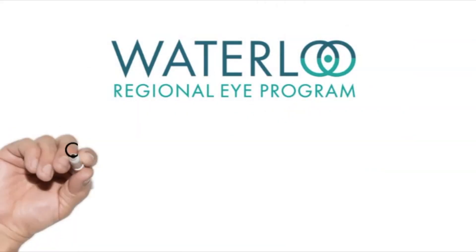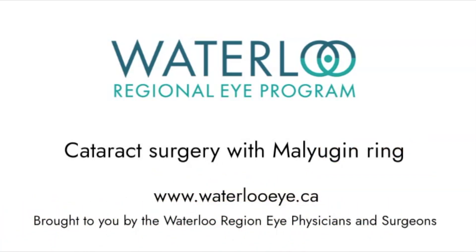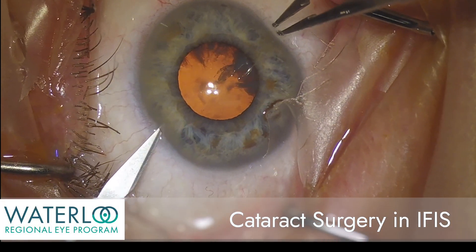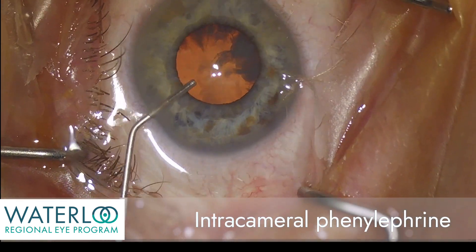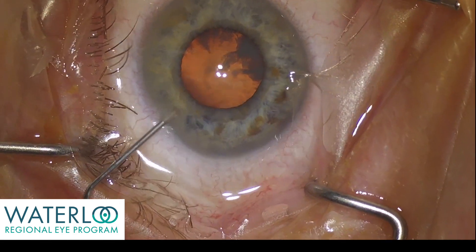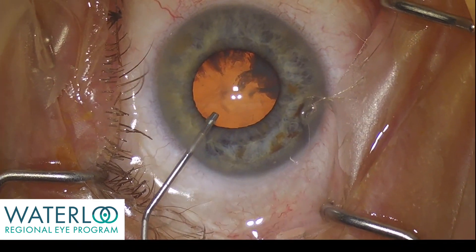In this video I'll take you through cataract surgery in a patient with intraoperative floppy iris syndrome, a condition where a malyugan ring is sometimes required to support the iris. Phenylephrine is a medication injected into the eye to dilate the pupil, and viscoelastic is a gel-like material used to maintain the eye pressure. Here it is injected under the iris to prepare for the malyugan ring.